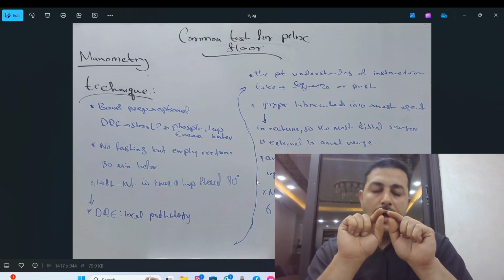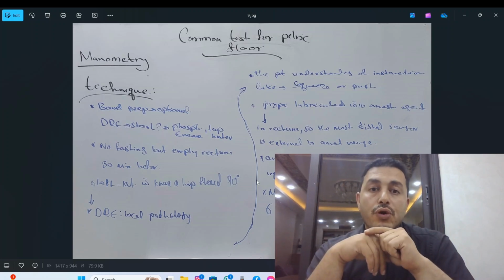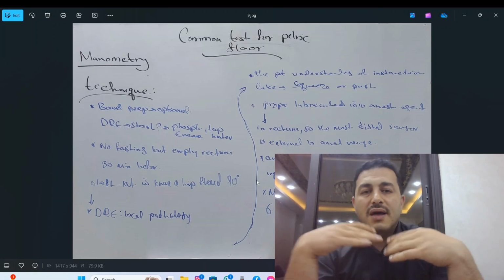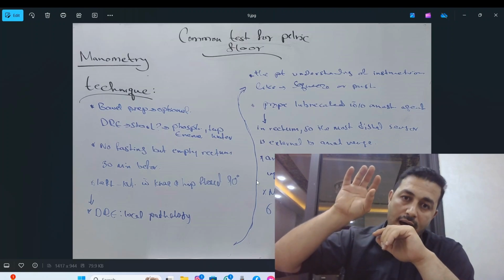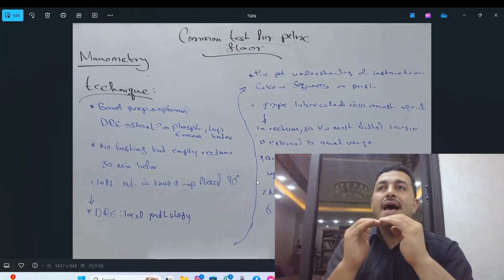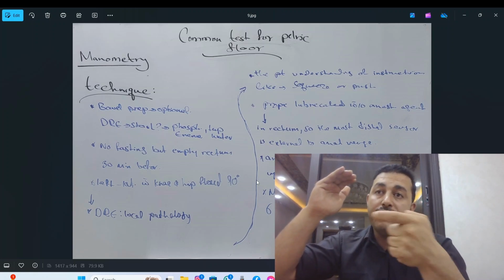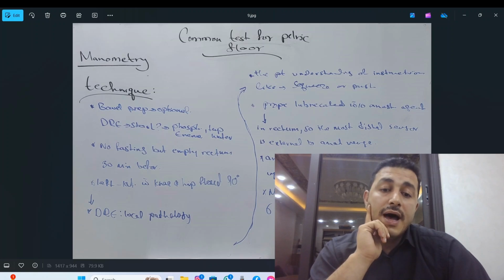When we place the pressure sensor probe, we said we have different models, but what we should keep in mind is that the last sensor should be seen at the anal verge. The balloon, we said that we have a balloon in the tip that should be placed in the rectum. So it should be at least 4 to 5 centimeter from the upper anal canal, from the anorectal ring, to ensure that it is in the rectum.